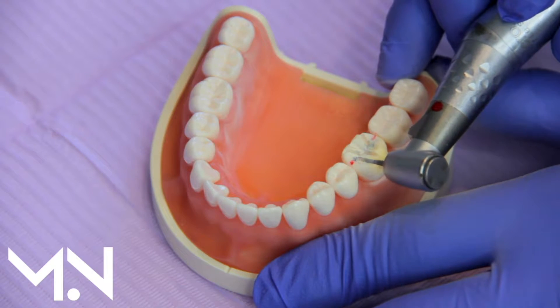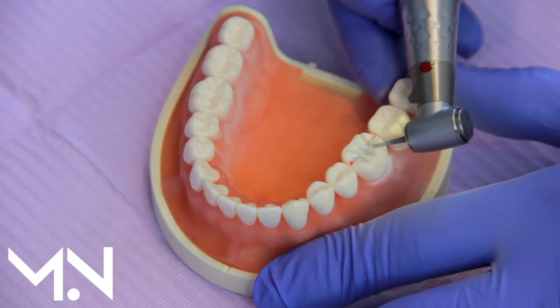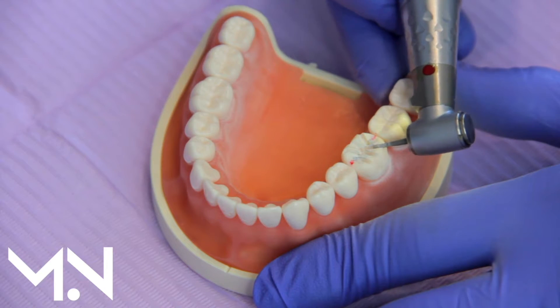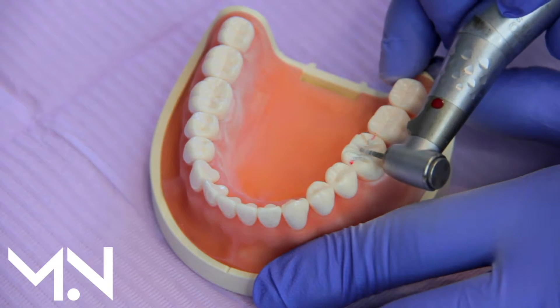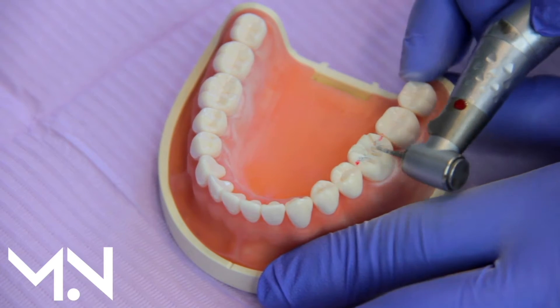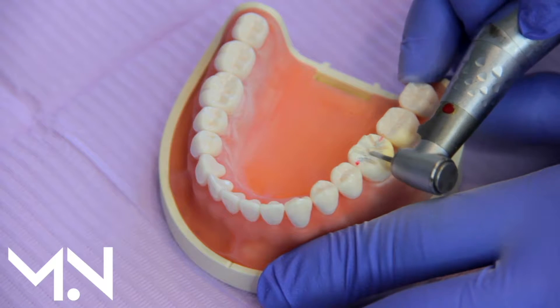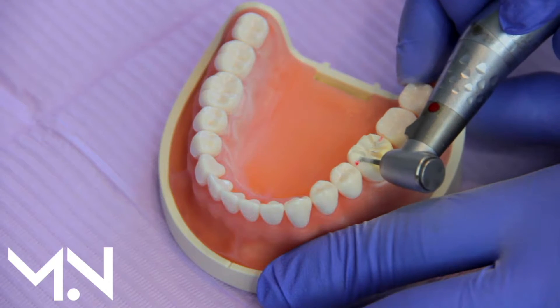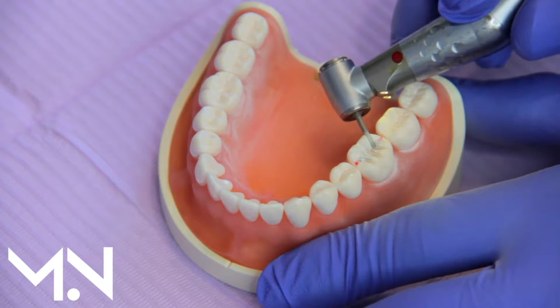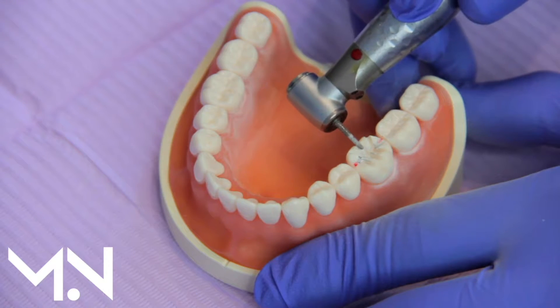I'm going around making several sets of these grooves and checking because I know how big this bur is — it's about 1.6 millimeters — so when I do this I can check that I'm deep enough everywhere. Now I can go and join these areas together.